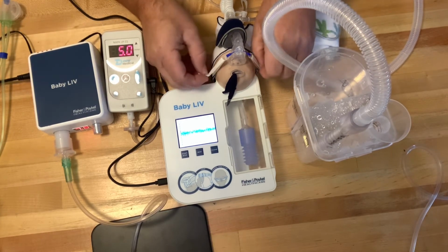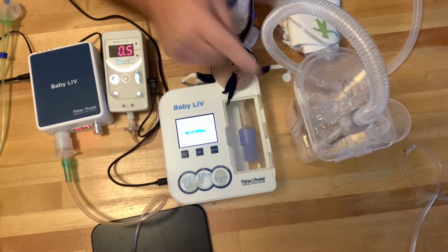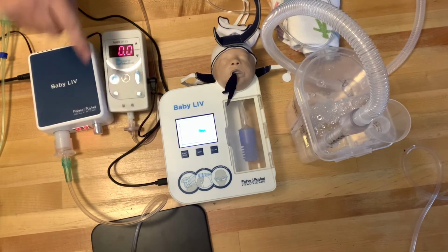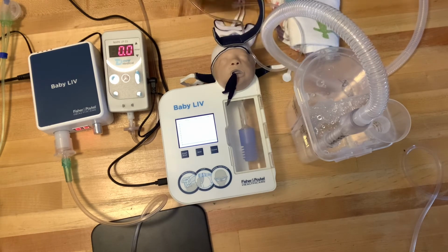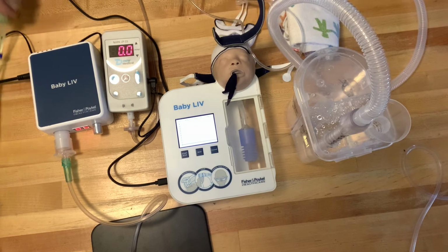First thing I'd like you to notice as soon as I take this off is the bubbles stop. My reading here drops down to 0, and my monitor also says 0. So the baby is no longer getting CPAP, and all of my devices are telling me that. So we go ahead and we take off our interface.